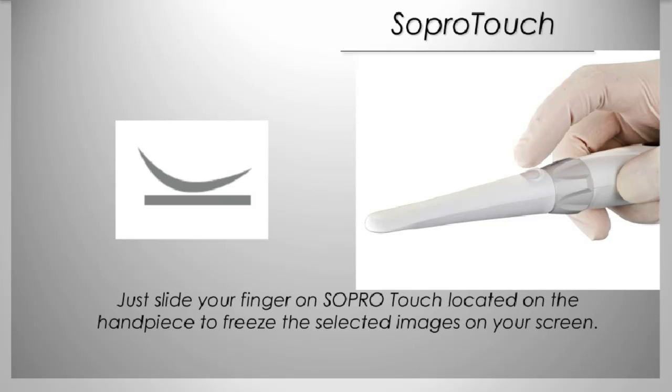This I really like, too. Coming back from maybe even 15 years ago was the first time I used an intraoral camera. And of the two that I used back then, one had a rheostat pedal, which you had to press pretty firmly, so much so that my body would shake a little bit when I was moving my foot, and then my image would blur. And then we all know of the other intraoral cameras that had the button on the wand part, you might say, but you had to press it and engage it. Again, it would blur or shake your image.